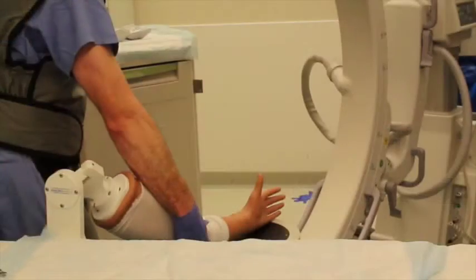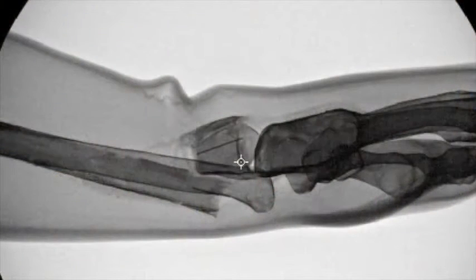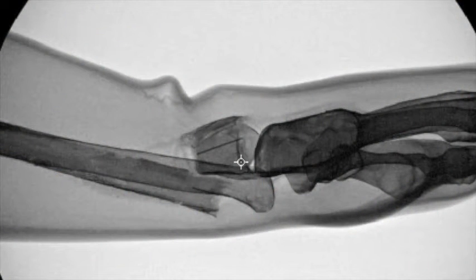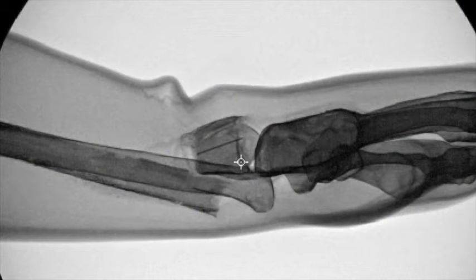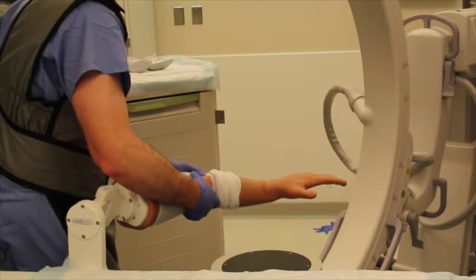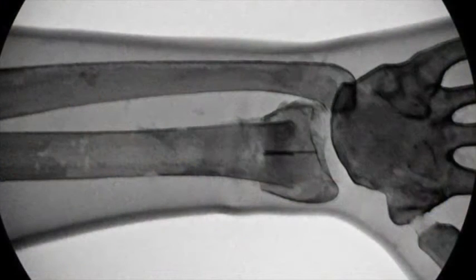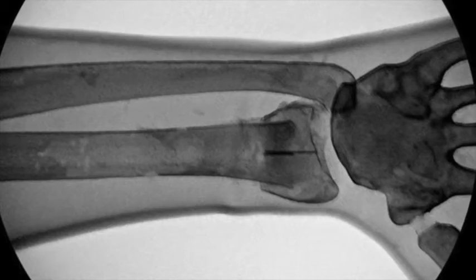X-ray imaging reveals the fracture in the displaced position. You can see wires in place demonstrating the degree of fracture displacement and angulation.